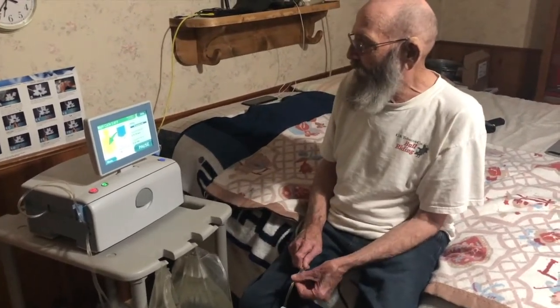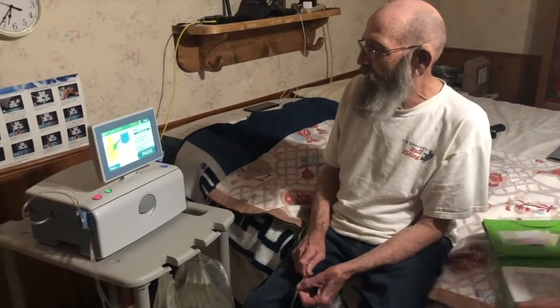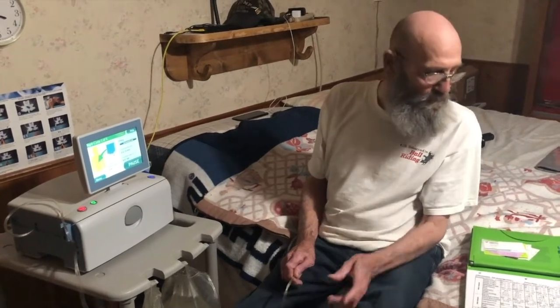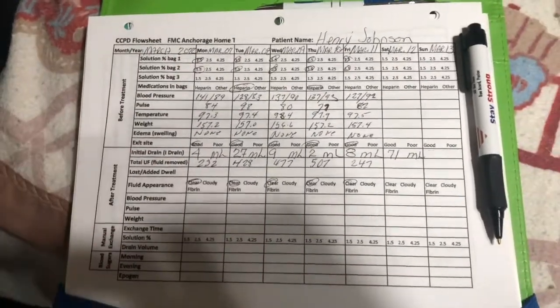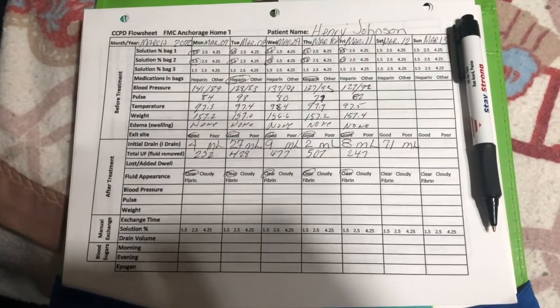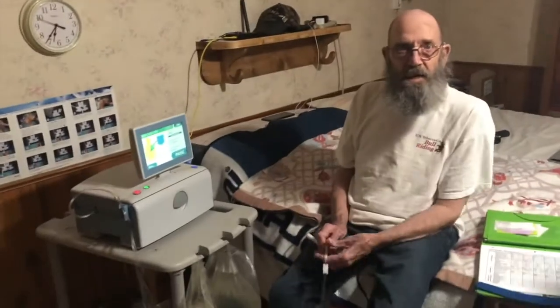And that cycle will last for an hour and a half, hour and 45 minutes, and then it'll pump it off and do it all over again. We do that 4 different times during the night. And you record the data? Yeah, everything's recorded right here in this book too. Plus it's all automatically recorded from this machine here, which sends all that data to town.